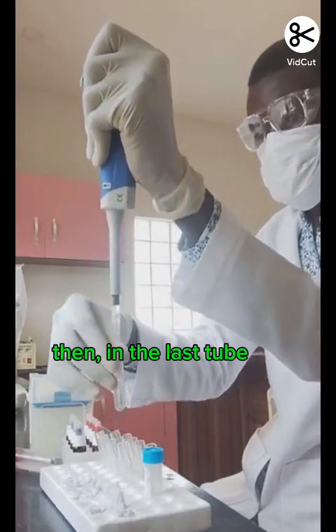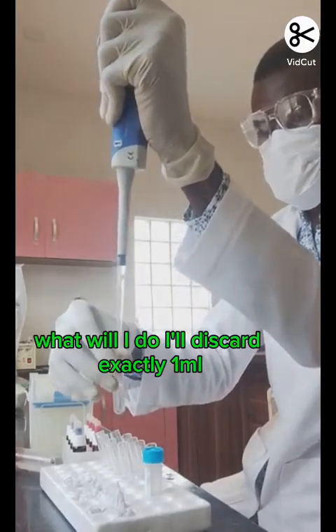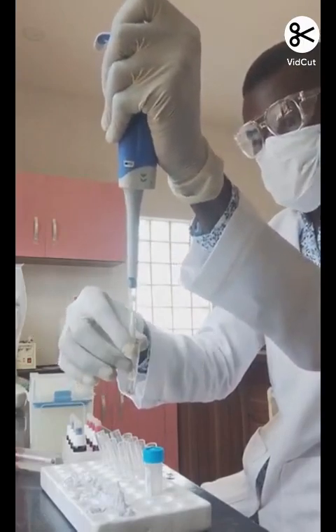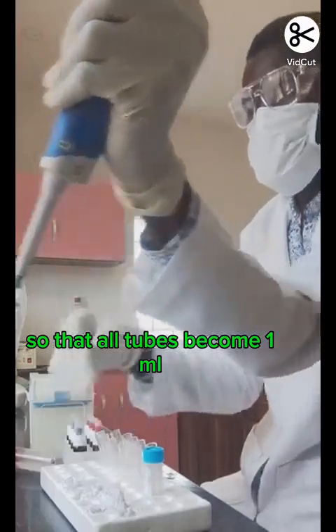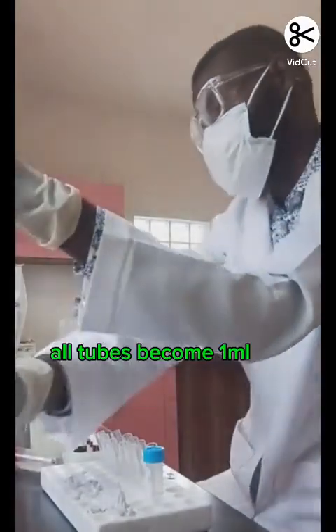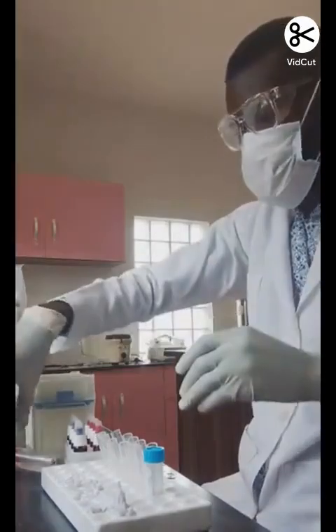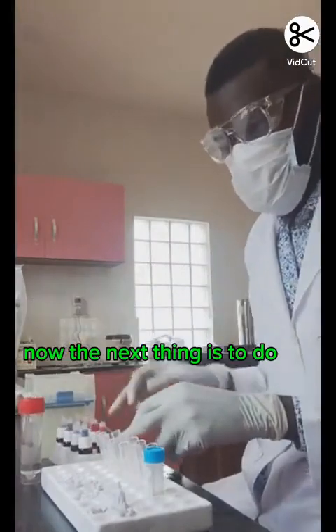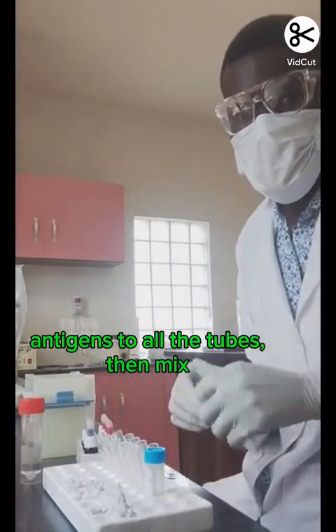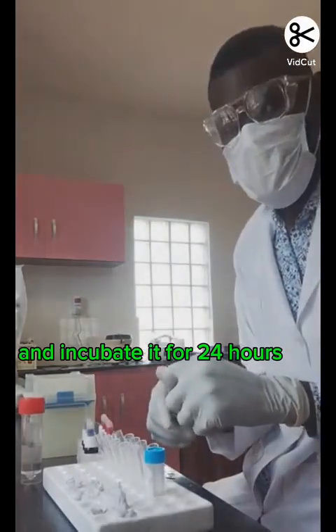Then in the last tube, after mixing, what will I do? I'll discard exactly 1 ml so that all tubes become 1 ml. Now the next thing is to add your febrile antigen to all the tubes. Then you mix and incubate for 24 hours.